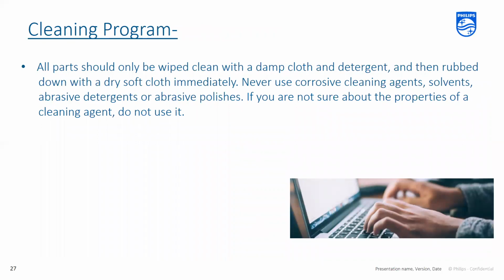In the cleaning program, all parts should only be wiped clean with a damp cloth and detergent and then rubbed down with a dry soft cloth immediately. Never use corrosive cleaning agents, solvents, abrasive detergents, or abrasive polishes. If you're not sure about the properties of a cleaning agent, do not use it. This is the cleaning aspect. We will go into the disinfecting next.